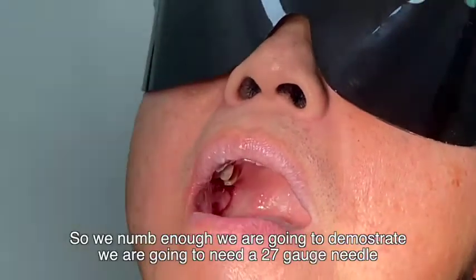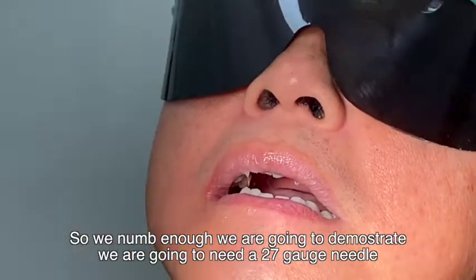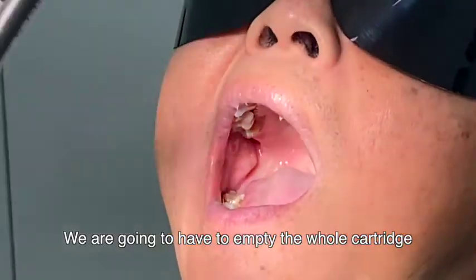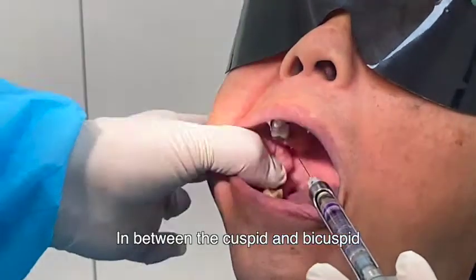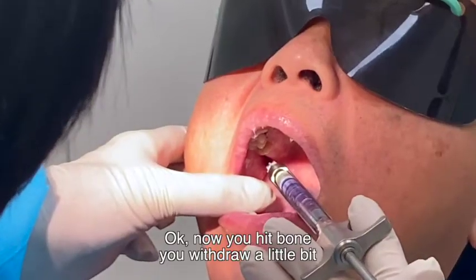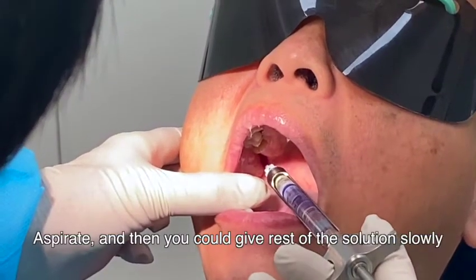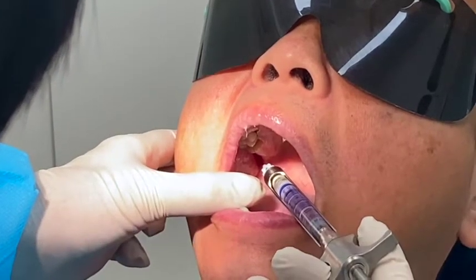Okay. So now we're going to demonstrate. You're going to need a 27 gauge needle. You're going to have to empty the whole carpule, in between the cuspid and bicuspid at that angle. Okay, now you hit bone. You withdraw a little bit, aspirate, and then you give the rest of the solution slowly.